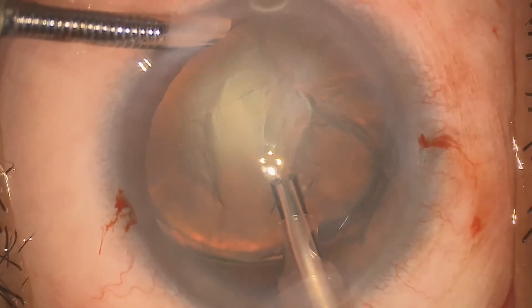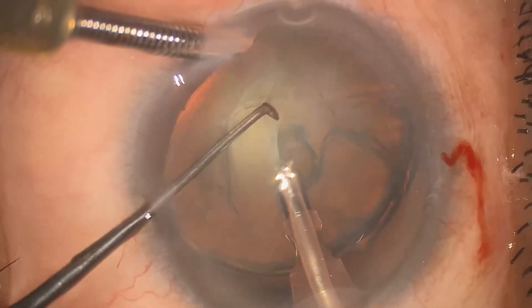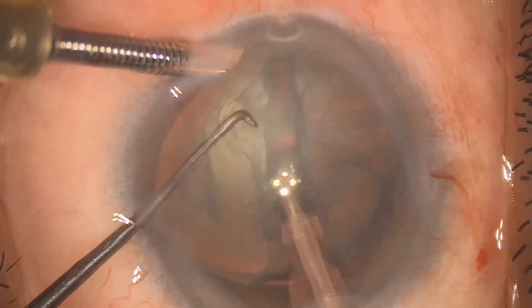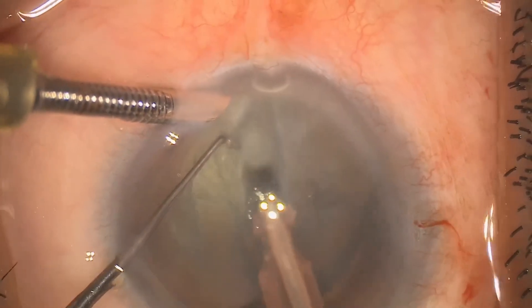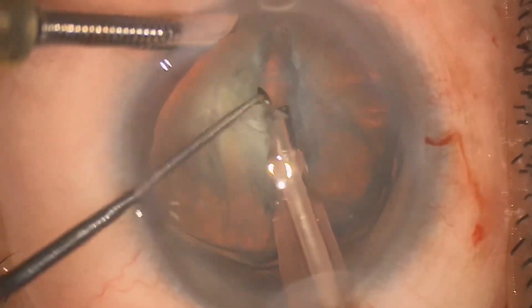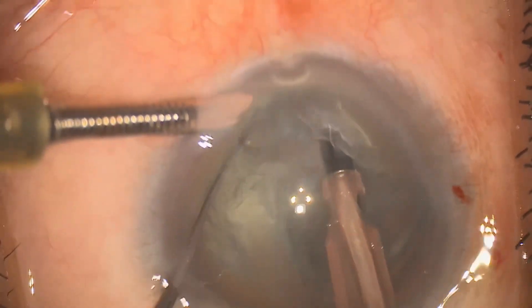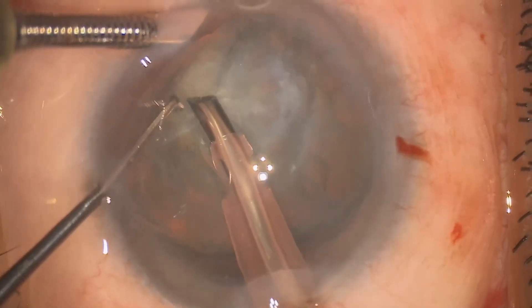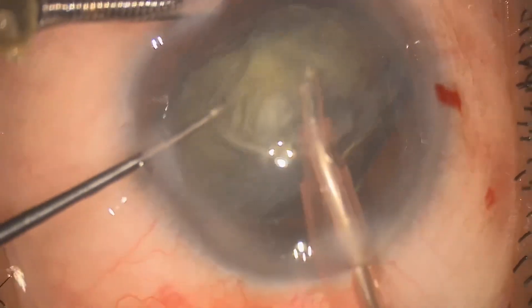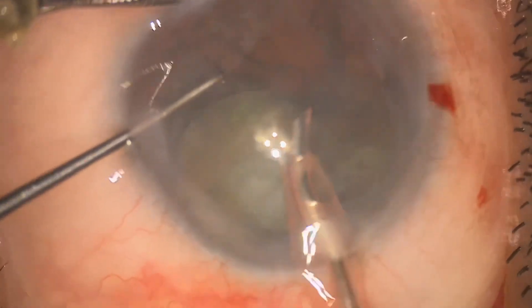Now we are starting with the FACO. For complicated cases I suggest you perform the best FACO technique for yourself — for me it is stop and chop. Here I am performing stop and chop with low FACO parameters, starting with sculpting. The trench should be around 80 to 90% of the nuclear thickness, and try to avoid mechanical stress on the zonules. After completing 80 to 90% trenching, gently separate the nucleus and avoid zonular stress. Start emulsifying the hemi-nuclear portion at the level of the iris plane and in the center area, just to avoid uneven stress on the zonules. Perform this all under low parameters and gently.